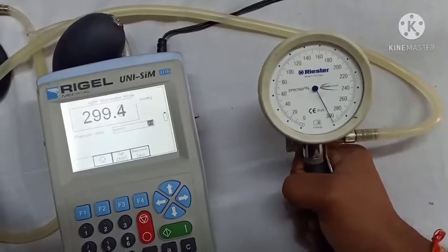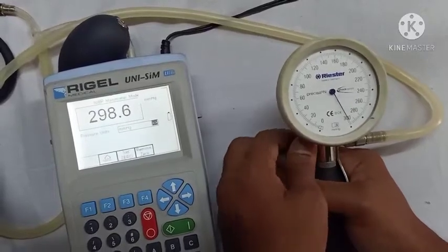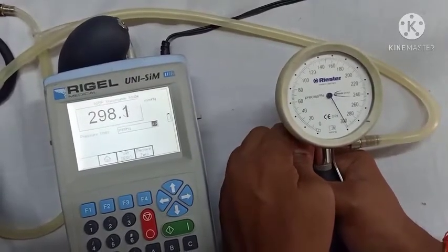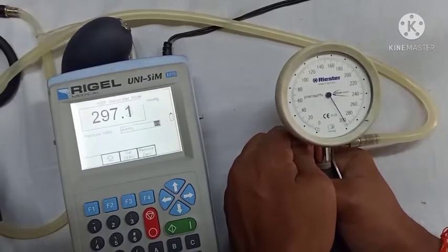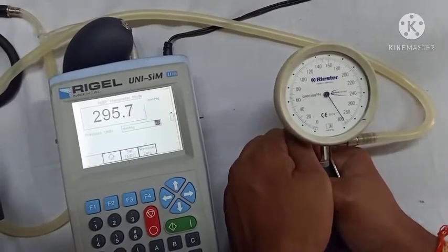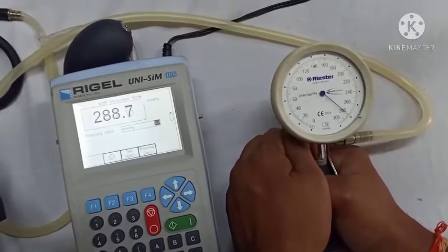After completing the readings in increasing order of pressure, we now start taking readings in decreasing order of pressure. For this, we start releasing pressure using the pressure release valve and record the reading at each calibration point in decreasing order.